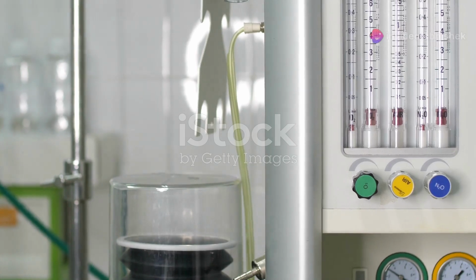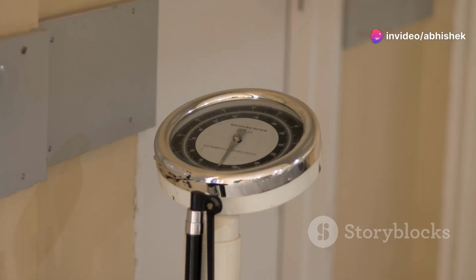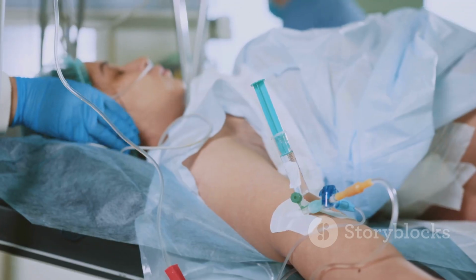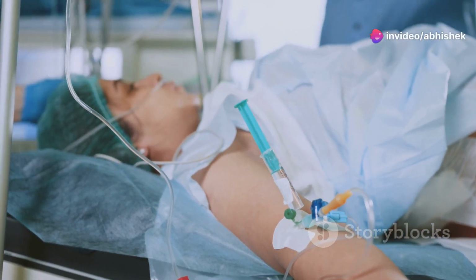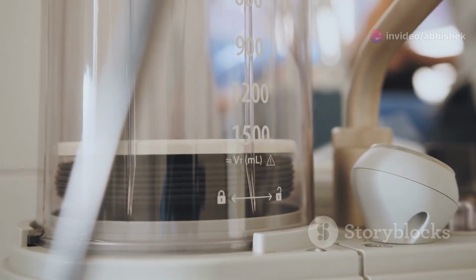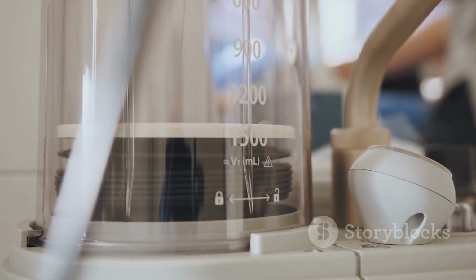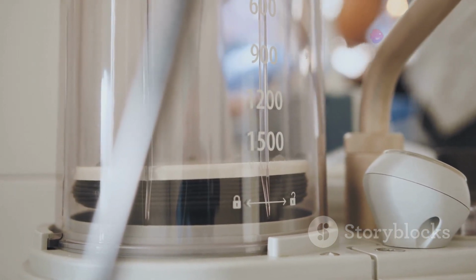Now that we have our gas flow sorted, let's talk about the vaporizer. This is where things get a little more interesting. The vaporizer is a critical component that allows us to add precise amounts of volatile anesthetic agents to the fresh gas flow. These agents, typically in liquid form, are what actually put the patient to sleep and keep them unconscious throughout the surgery. The vaporizer turns these liquids into a vapor, which is then mixed with the oxygen and nitrous oxide flowing from the gas delivery system.